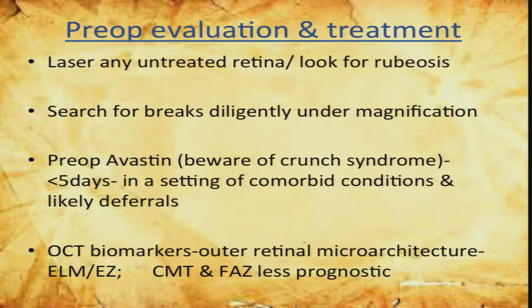As much as possible, we must try to identify the breaks, if not preoperatively, at least intraoperatively, because the more breaks we create, each break individually increases the chance of a recurrent detachment. So there should be a very high threshold for creating any new breaks intraoperatively.